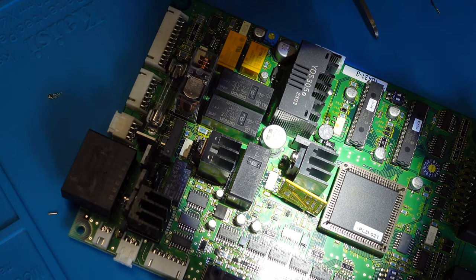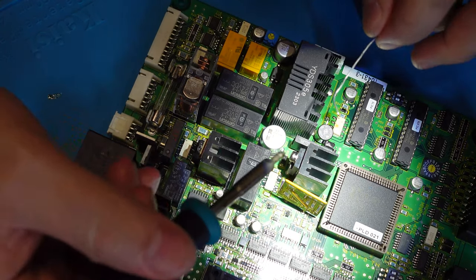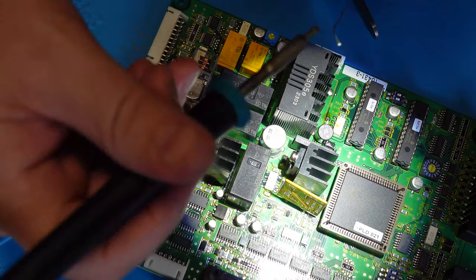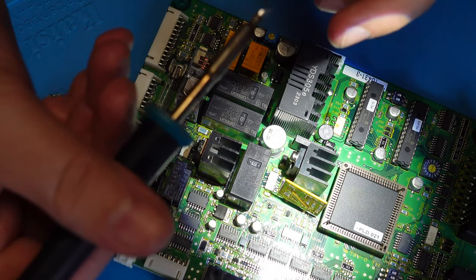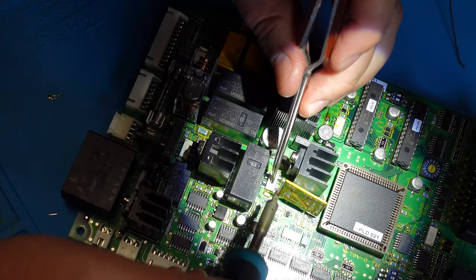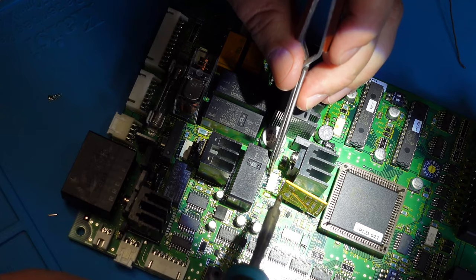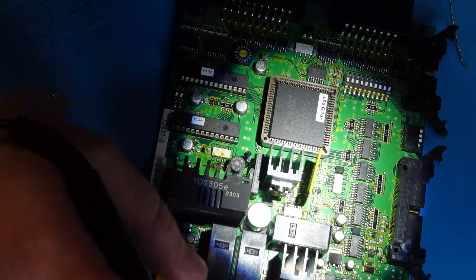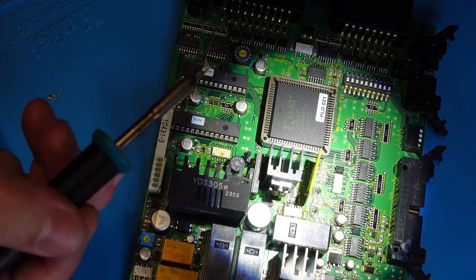So the way I'm gonna approach this is, because it's in such a tight area, I'm going to go ahead and stick some solder on one or two of the legs and keep it oriented exactly where I want it, and then I can tack down all the rest. So in order to do that, I'm gonna clean my soldering iron. We're going to put some solder here, and I'm gonna hold the chip down. Tack that one leg down. I'm gonna move it over a little bit. I'm gonna tack this front corner leg, and that should hold my chip completely in place while I tack down the rest of them.